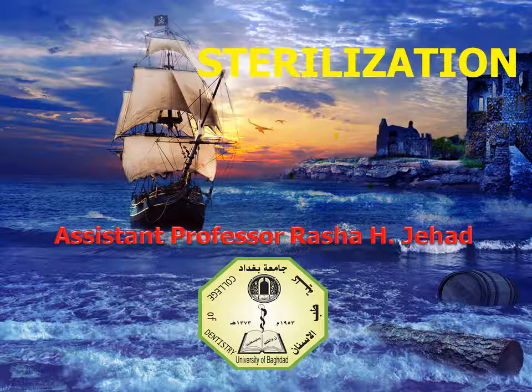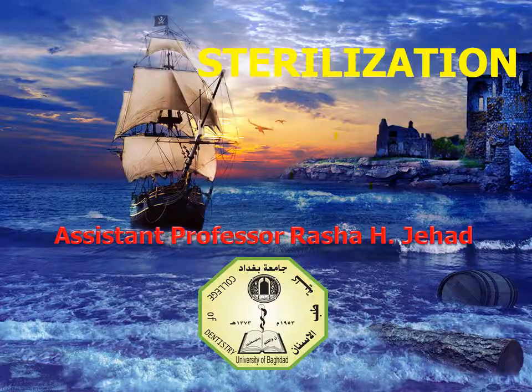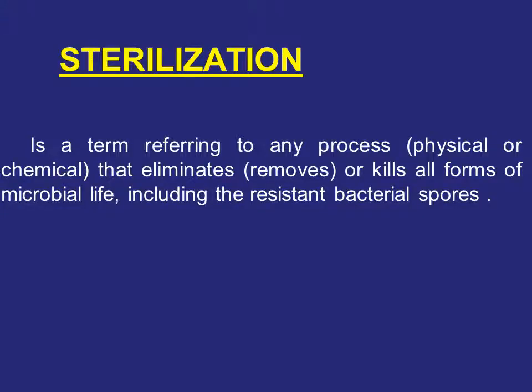Our lecture is about sterilization in operative dentistry. This defines sterilization. It's the use of any physical or chemical means to remove, eliminate, or kill any form of microbial flora, including bacterial spores.